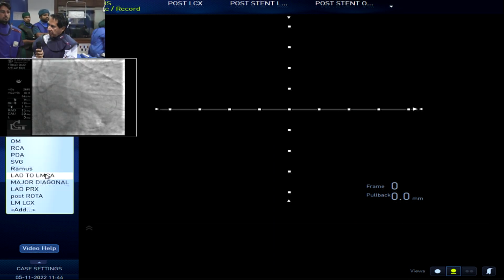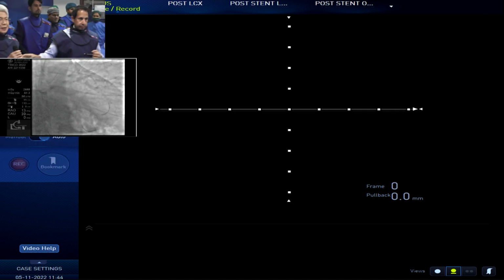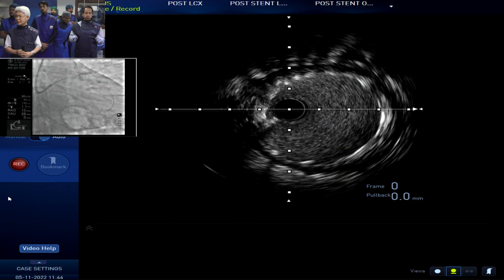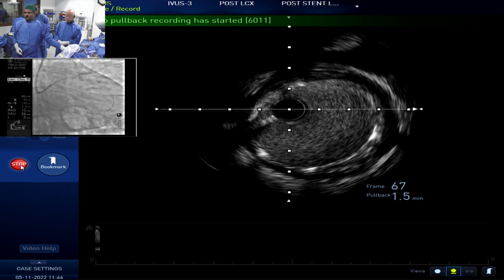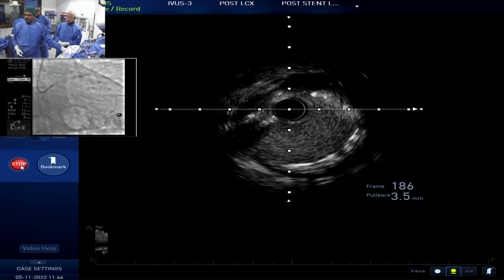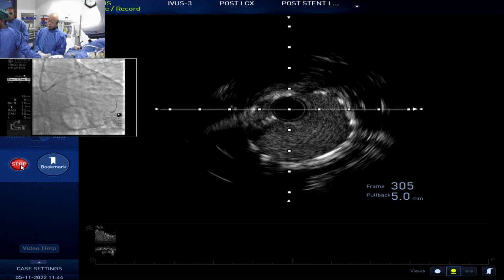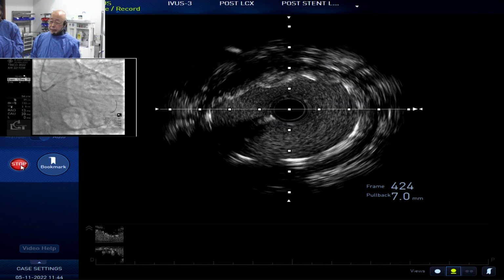That's Dr. Akasaka. Does it change the anatomy if you do a kiss in the left main? Yes, definitely. Dr. Saito, we usually know that whenever a KBI is done, then repot should be done. Yes, POT should be done. Otherwise, recrossing of the wire is difficult sometimes. And with such a short stent, repot is possible while avoiding the circumflex ostia.